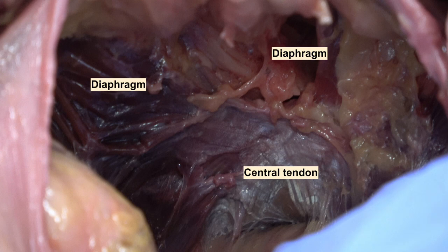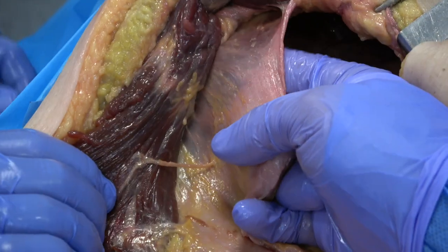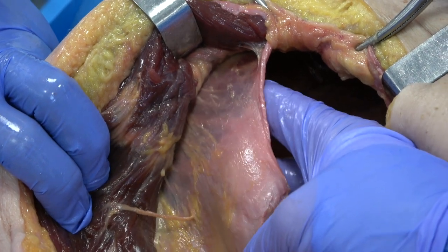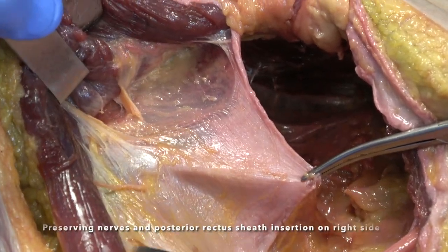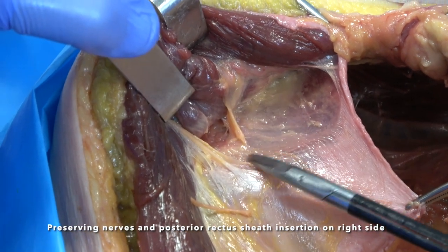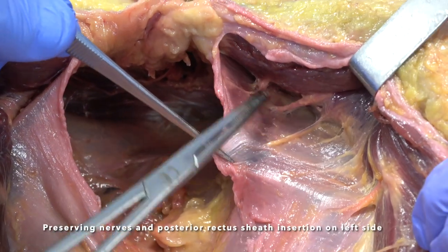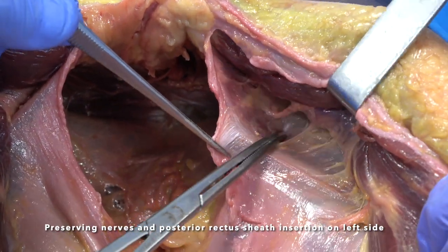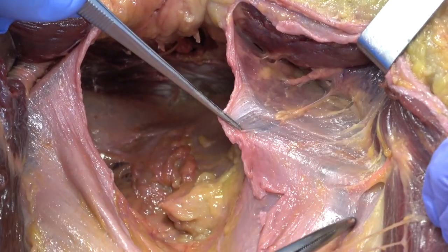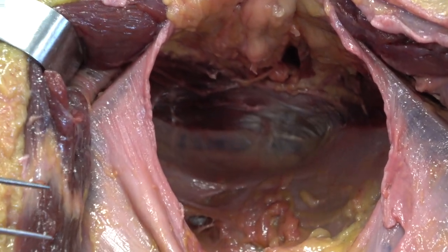Following the dome shape of the diaphragm, the layer is continued peeling the diaphragm off the fascia diaphragmatica. This way we will avoid iatrogenic Morgagni hernias through the diaphragm. Here we are showing the preservation of the posterior rectus sheath insertions on costochondral cartilages and the preservation of the nerves that innervate the rectus abdominis muscle. This dissection can be followed up to the central tendon without starting the lateral release on the posterior rectus sheath.